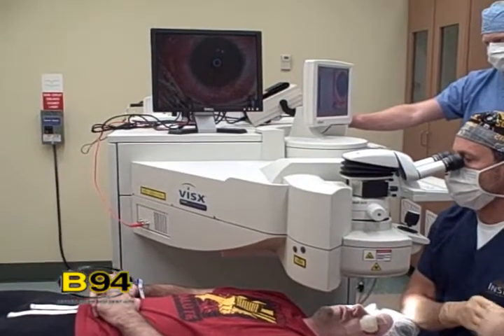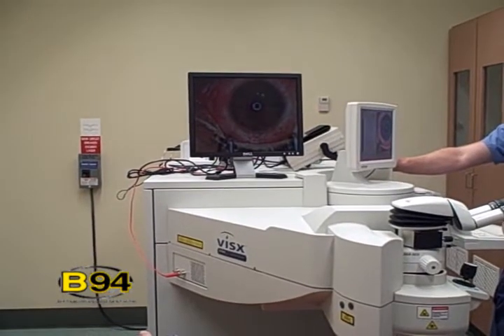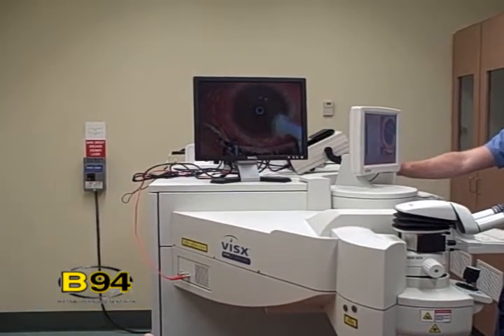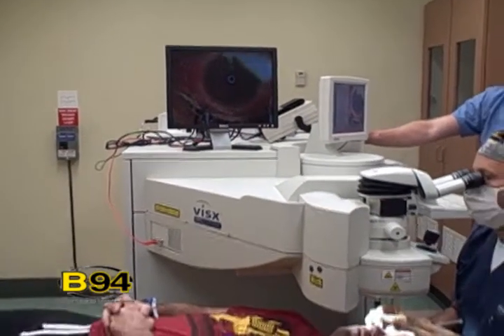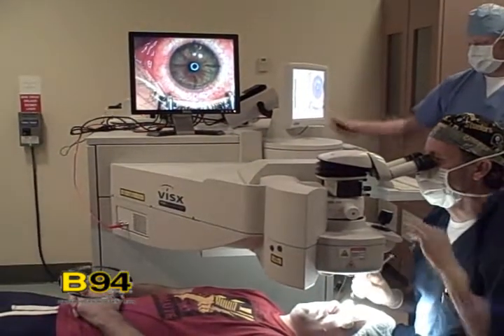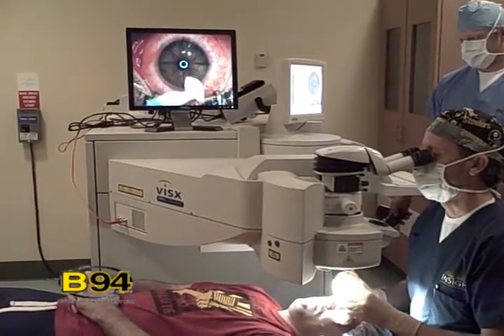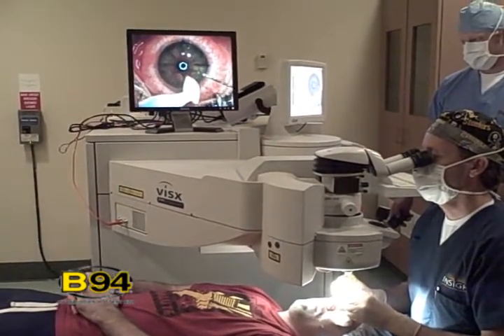That's pretty much the procedure. Once the laser's done its work, the flap goes back and you have to be careful not to rub your eyes. It heals beautifully for most patients, as long as you don't stick a finger in your eye or rub it out of place, and we'll make you wear shields at night to prevent that. So you'll do great.